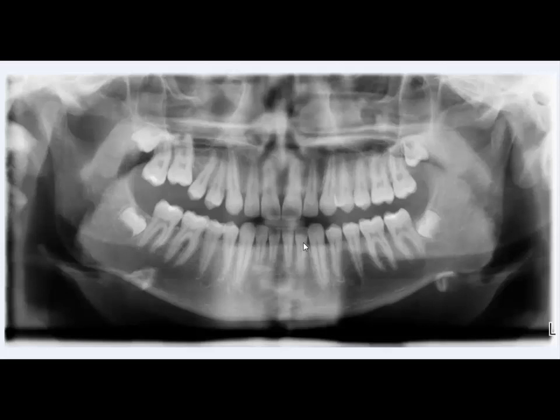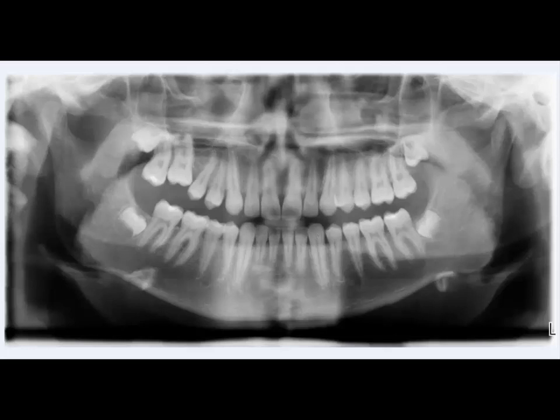This is another OPG. You can see here all third molars are under eruption, and almost all teeth are healthy.